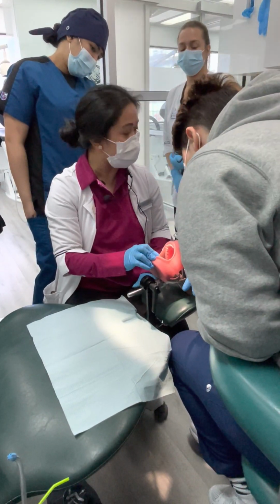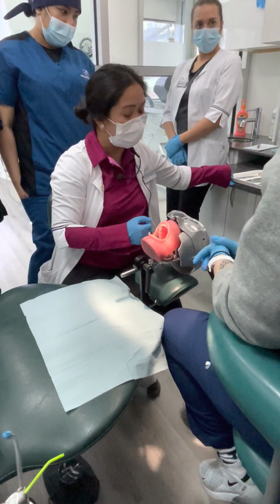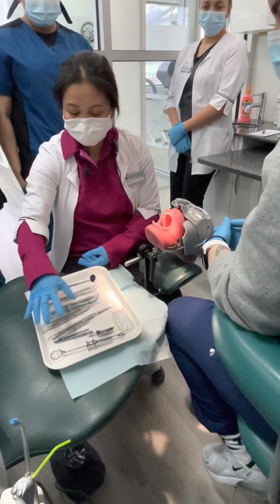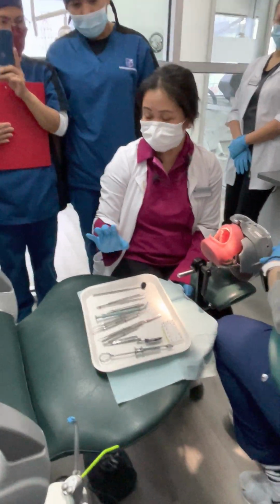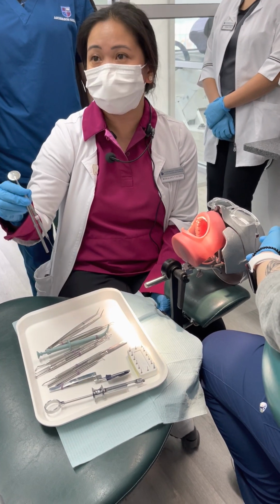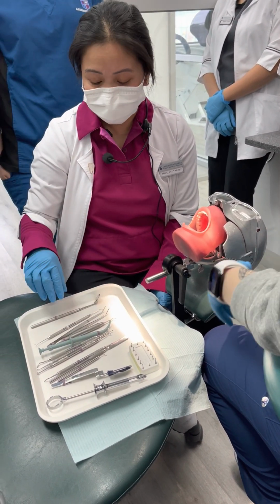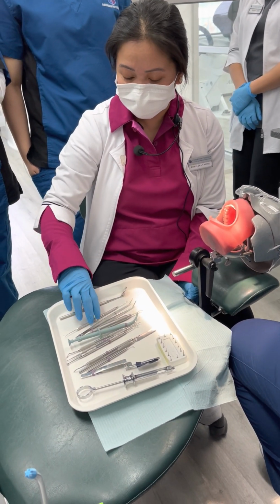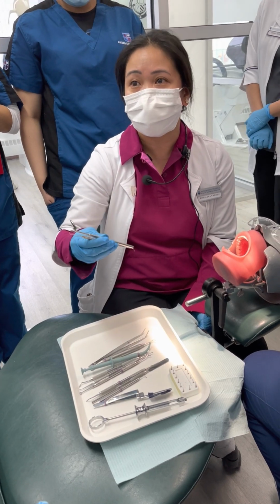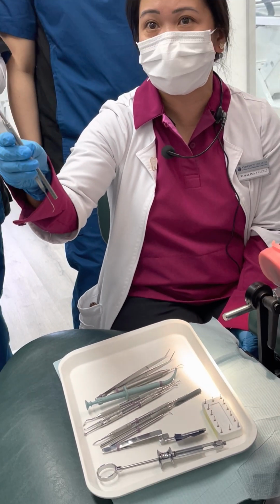You're gonna be in trouble now if you're not gonna do this right. Come, see here. I'll put this one here first so she can reach. Most dentists take the instruments themselves, especially these two. But I'm a lazy dentist, you'll pass it to me. So in your exam, you're gonna do that too. These two instruments will be passed together. The rest is one by one. These two are partners, husband and wife, boyfriend and girlfriend.